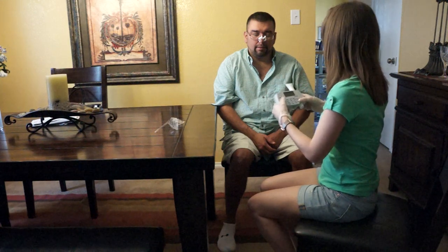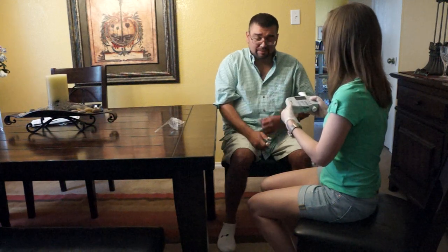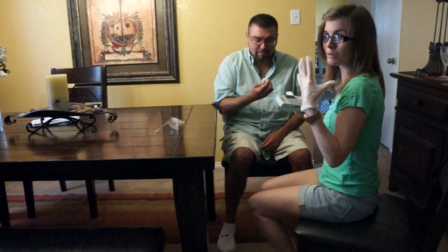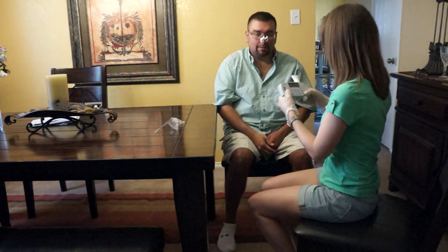Okay, you ready for the last one? Did you want to take those nose clips off for a second? Kind of. Those nose clips are really hard, so if they want to take them off for a second, just to feel a little bit better, and then put them on later, that's good too.